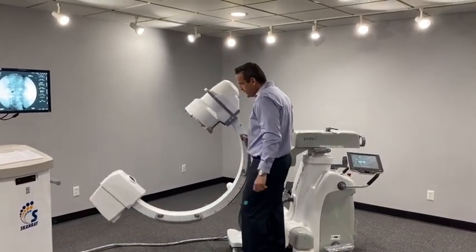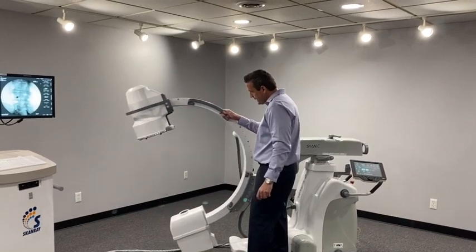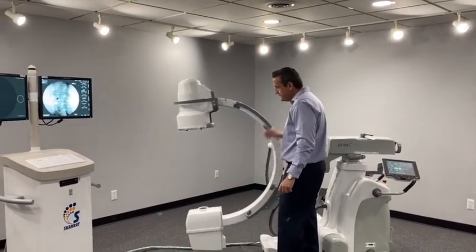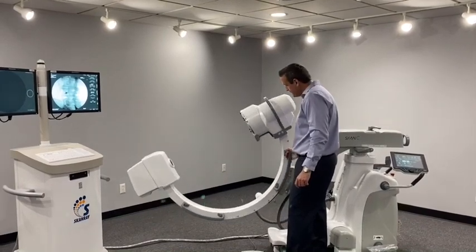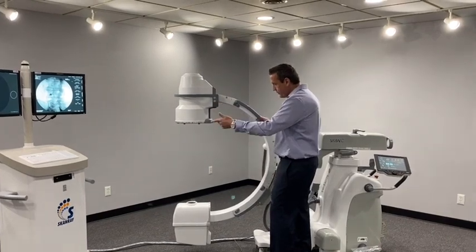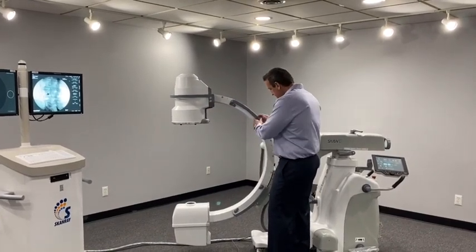Now we're going to go into the movements of the system. It's 40 degrees of over-rotation and 90 degrees lateral. You can see every movement on this system glides — it's effortless and moves very smoothly. We are 40 degrees over and 90 degrees lateral.